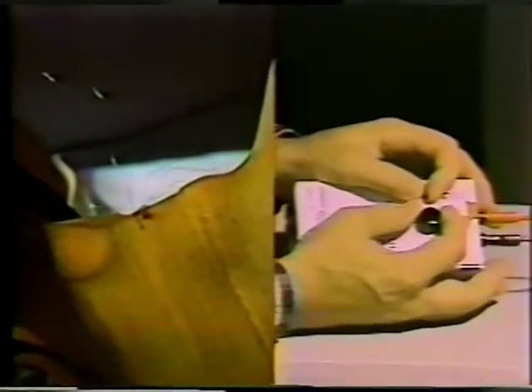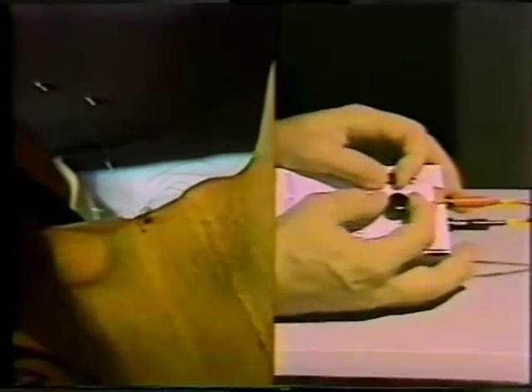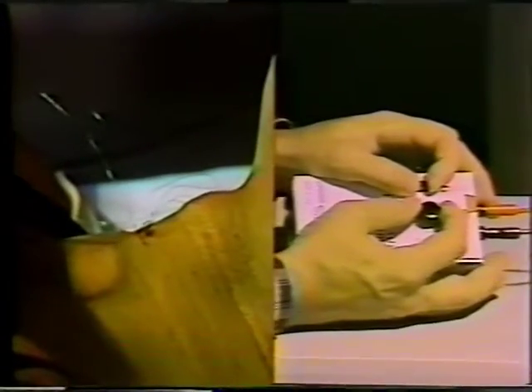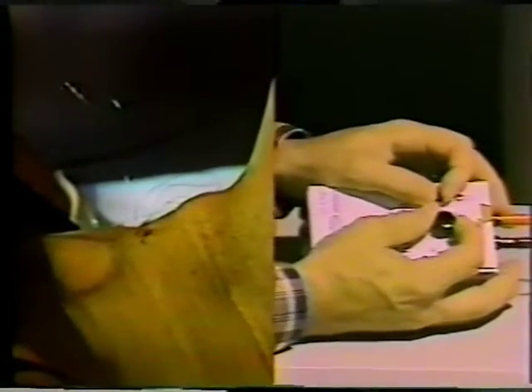In this case, the downward motion of the larynx and the termination of phonation with muscle stimulation suggests that the electrode was located either in the sternothyroid or sternohyoid muscle. A second electrode placement was then conducted.